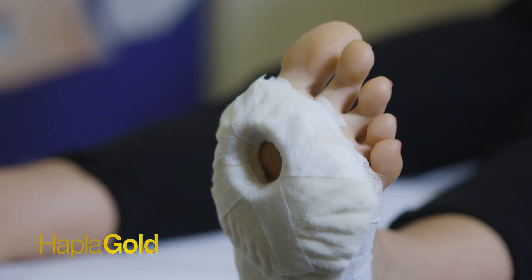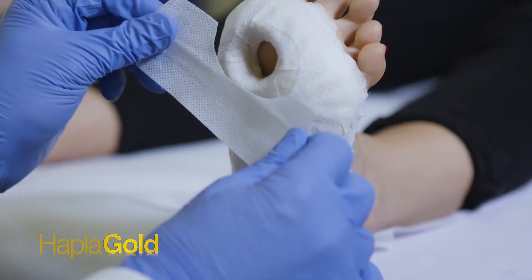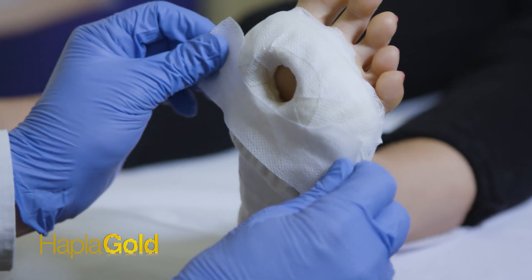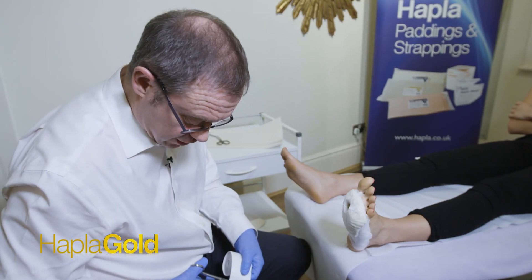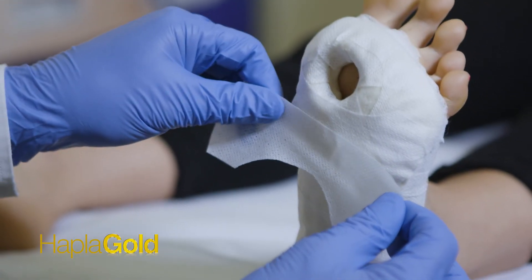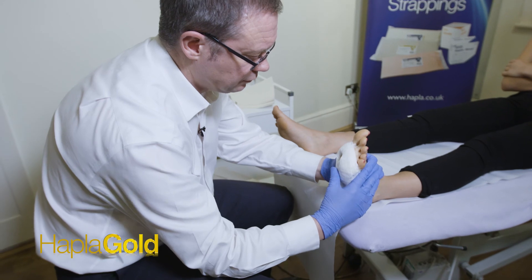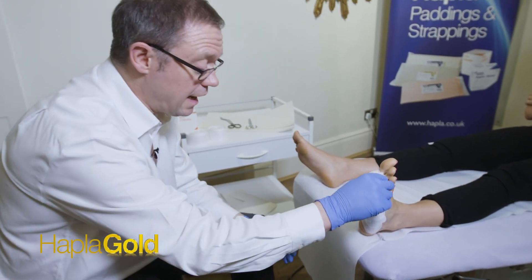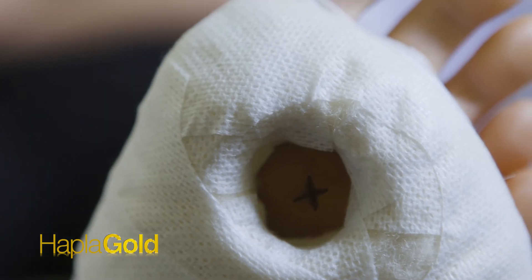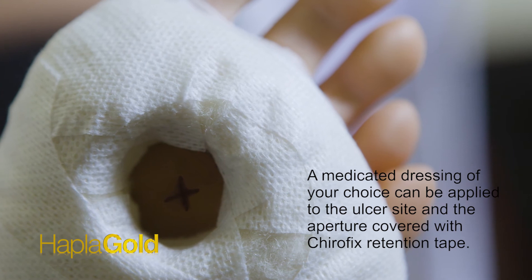With the aperture held open, we can now apply the retentive strapping, which will secure this final plantar cover against the plantar slab and reduce its movement. And there we have a rapid system that allows us access to the wound, to visualise the wound, and will completely offload that overloaded area.